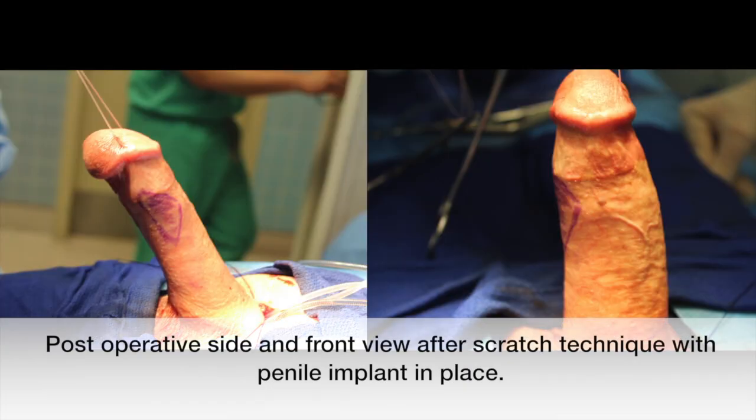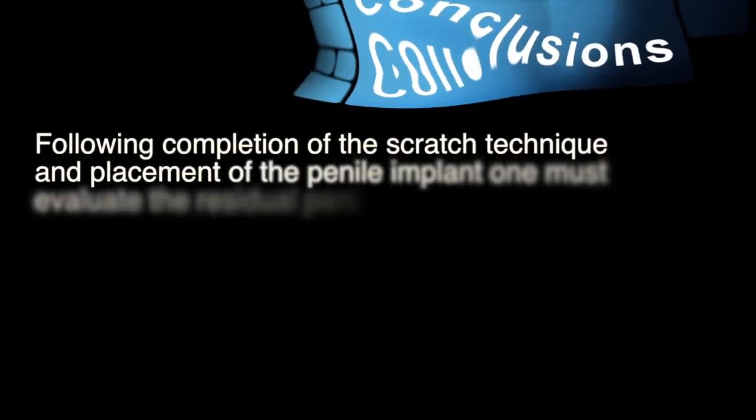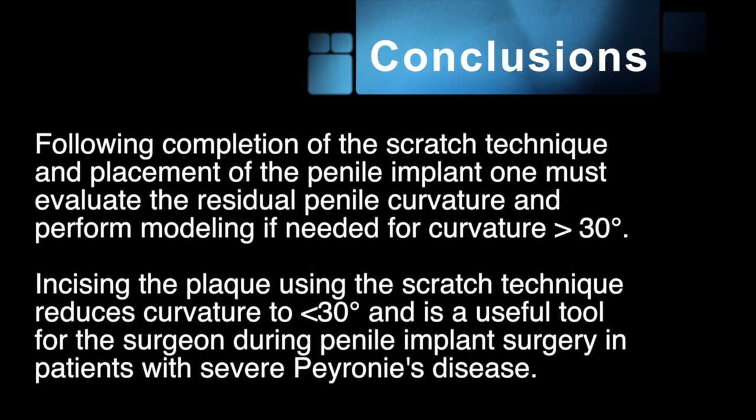Here we see a post-operative side view and front view after the scratch technique with penile implant in place. Following completion of the scratch technique and placement of the penile implant, one must evaluate the residual penile curve and perform modeling if the curve is greater than 30 degrees.